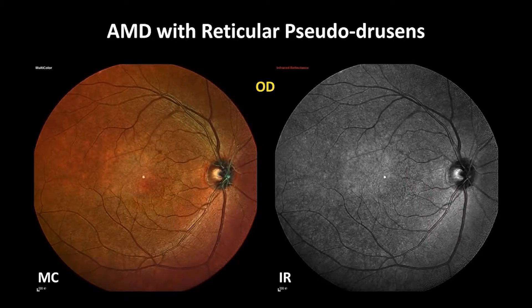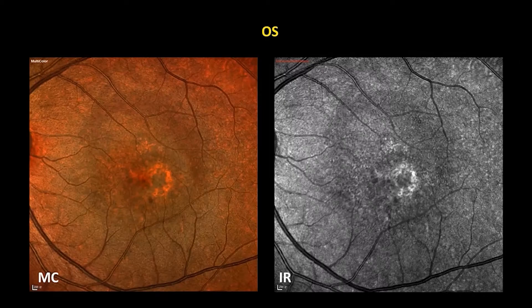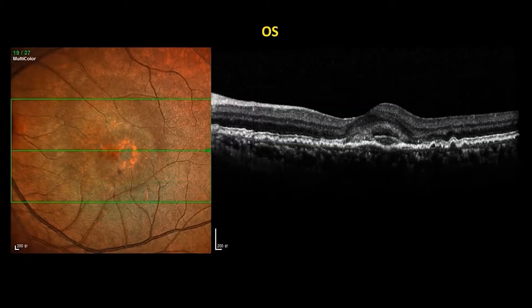Multicolor imaging is very useful to look at reticular pseudodrusen. On this case, the green-yellowish patches on multicolor in the macular area correspond to the pseudodrusen on OCT in the right eye. On the left eye, we saw similar changes on multicolor and infrared reflectance. We even see CNV on OCT.